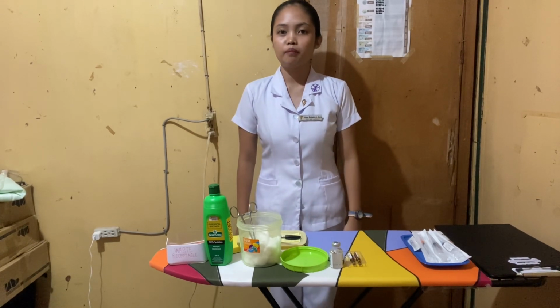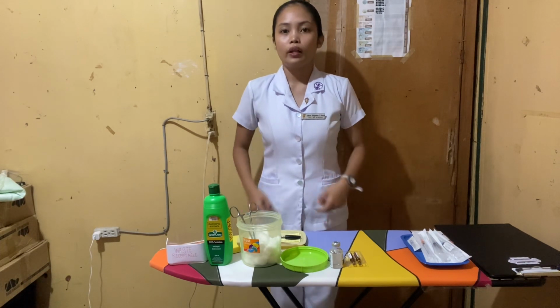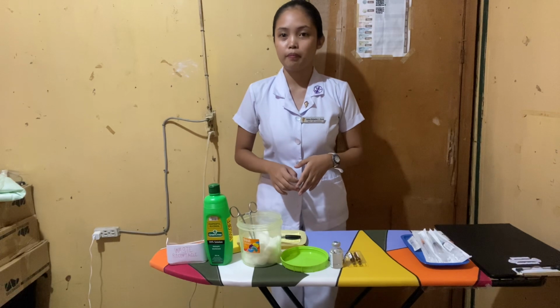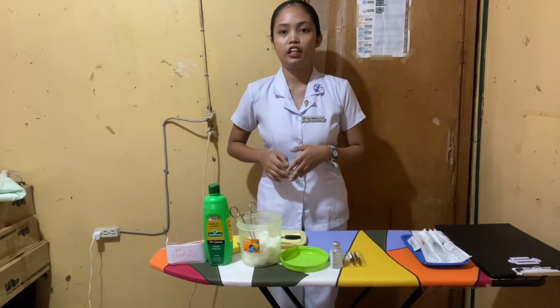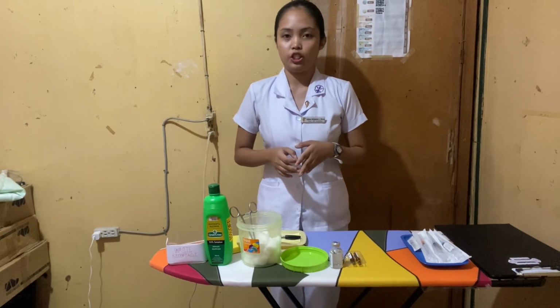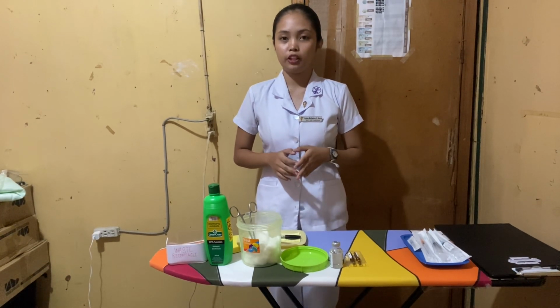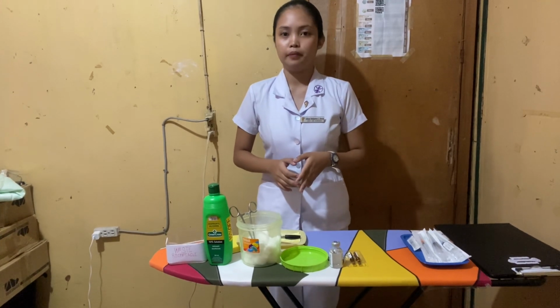In medication administration, it is important to perform the 3 checks. We'll have to check or read the label of the medication that is taken from the medication card. We'll have to read the label again before withdrawing the medication, and we'll have to read the label after withdrawing the medication. Now we will proceed to the preparation of the materials to be used. This is to conserve time and energy.